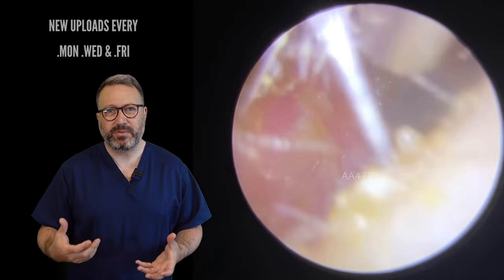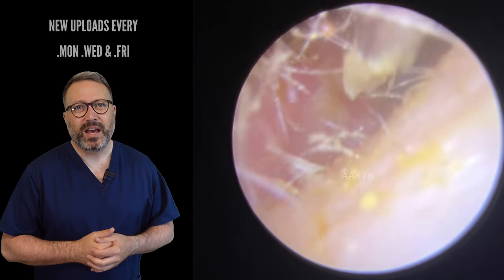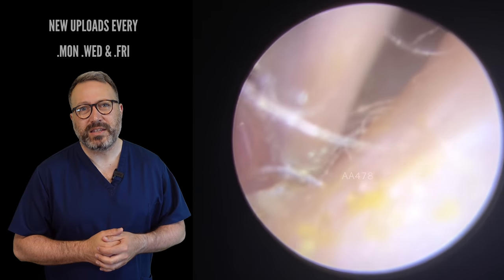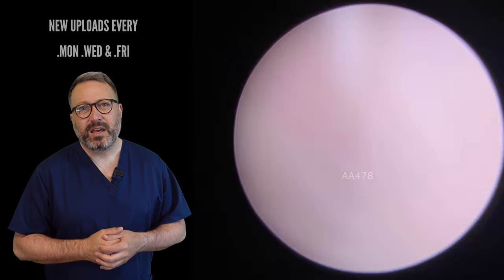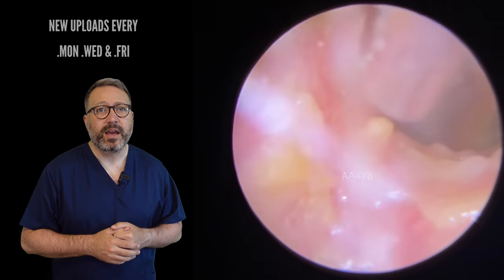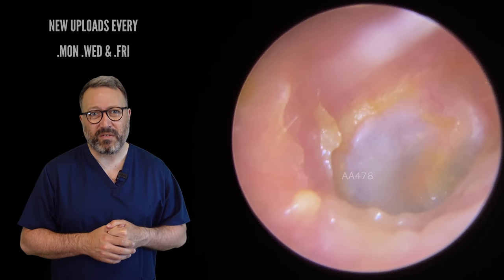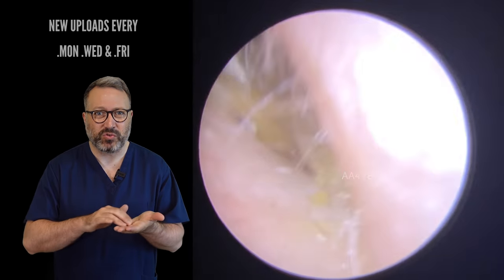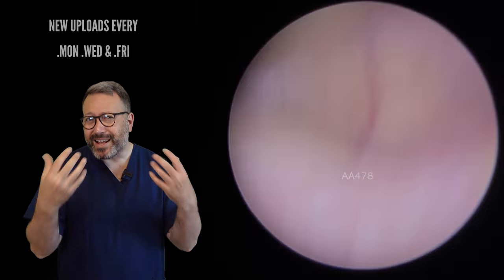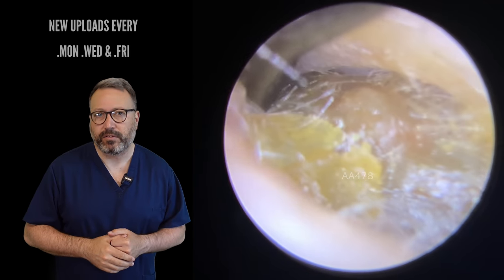That's quite common when you get these plugs in here, but we're just tidying up around that outside edge. Now, looking at those ear canals post-procedure — we've got the offending wax away. We don't want to cause any irritation or run any risk of infection by making cuts or grazes in there. So you'd normally say to that patient: keep those ears dry now for 24 hours. Just let the skin repair itself, toughen itself back up a little bit, and that ear canal will look lovely and healthy.